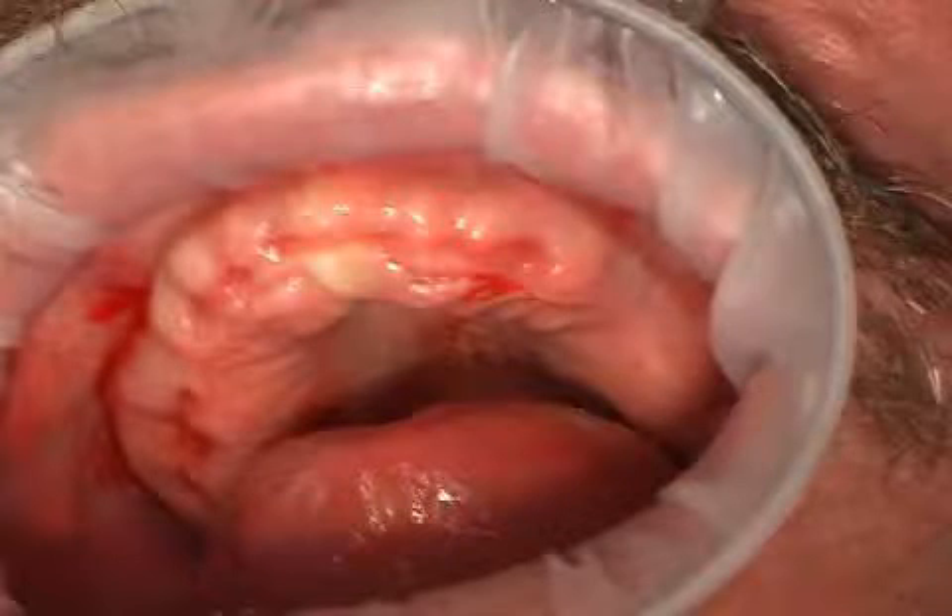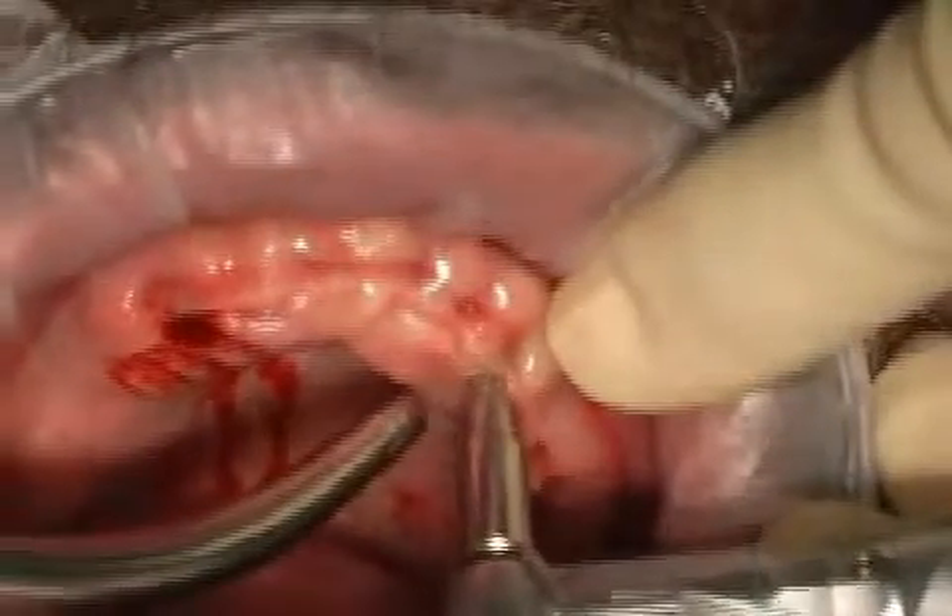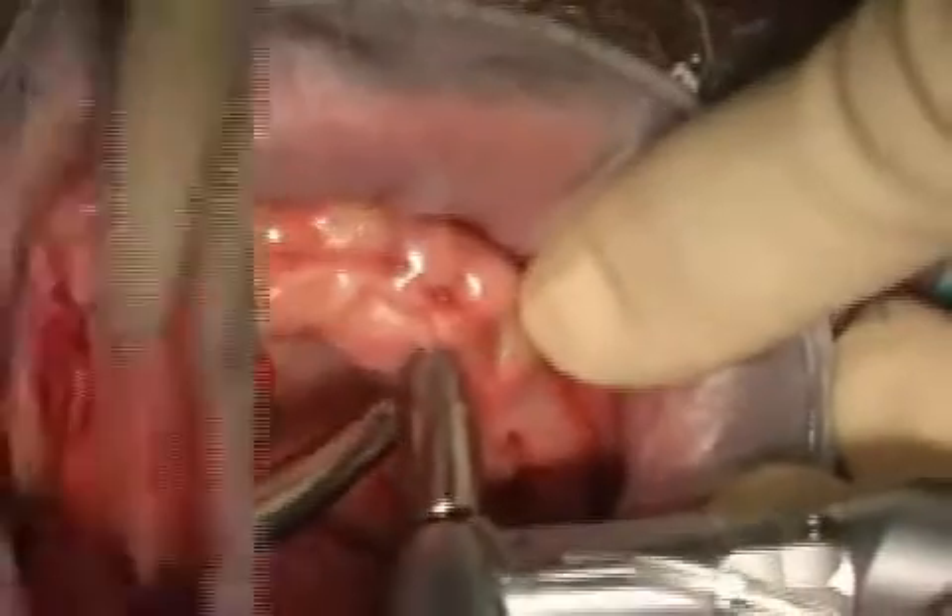The pilot drill is the name for the initial orientation bone drill in an implantation procedure. Here you see a toothless upper jaw — the patient will receive an implantation. The pilot drill serves primarily for orientation and provides the surgeon with a good overview of the bone quality. First, the mucous membrane is removed with a puncture.